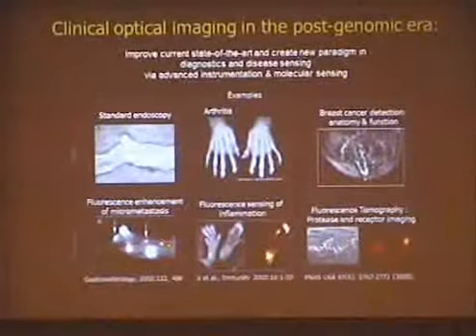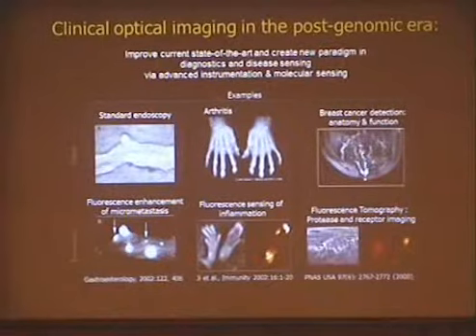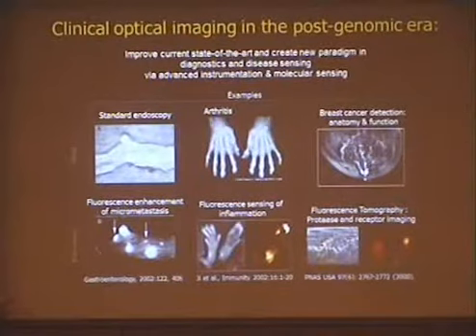So, as I said, this could apply not just to surgery, but potentially endoscopy, colonoscopy, and other endoscopies. And we like the systemic injection versus spraying, although I would be happy to discuss this, because especially in colonoscopy you have a large organ and it's better just to do a quick pass and know if there is any molecular abnormality based on the fluorescent signal.